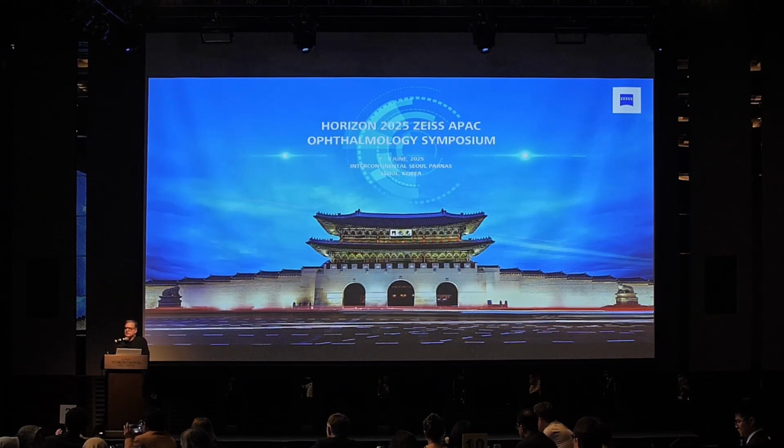We may have a little bit different capsular performance of a hydrophobic C-loop type lens. So maybe YAG laser is an issue which is asked a couple of years later with this type of lens. And as it's aberration neutral, I think the lens will also be forgiving in several aspects. So I expect at least these values, even better outcomes with the Ilana in the long run.